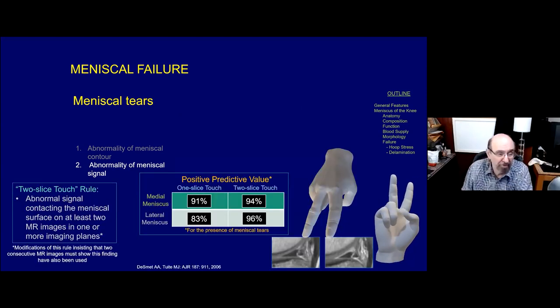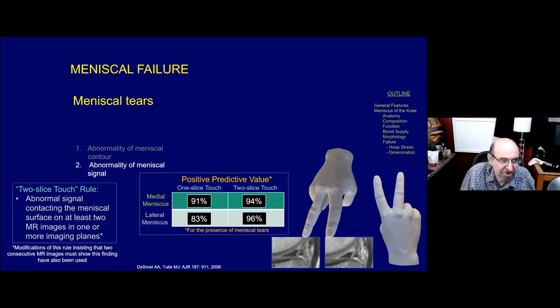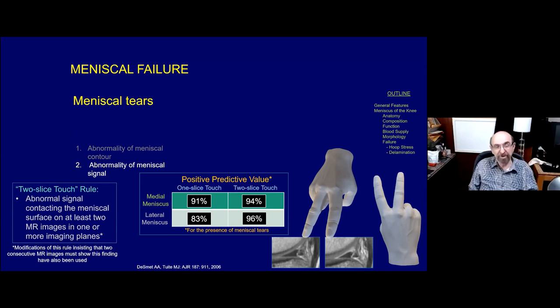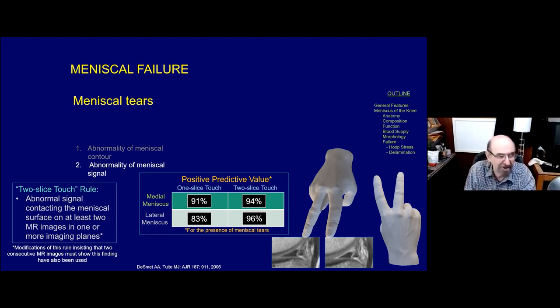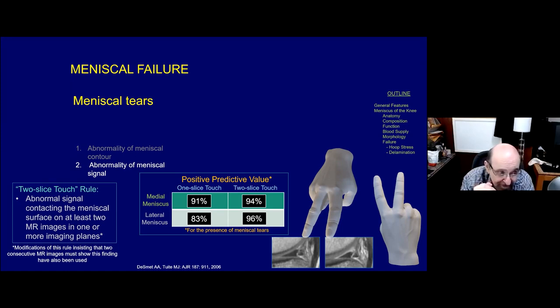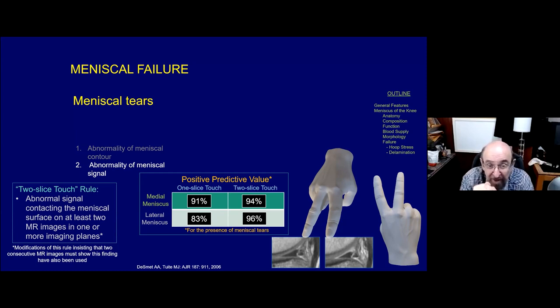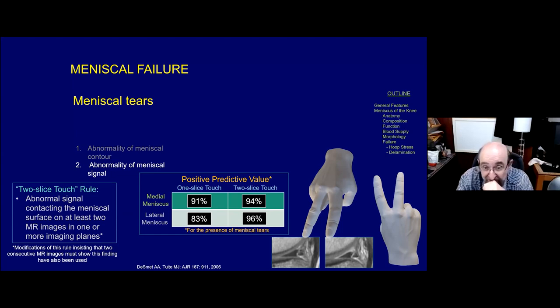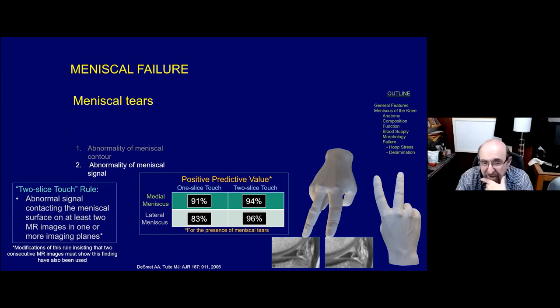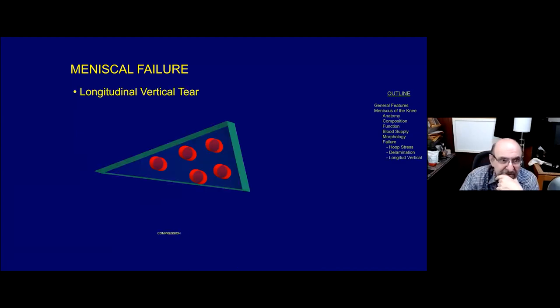Another suggestion to make the second criterion more reliable is the two-slice touch rule - the idea being that if you saw disruption of the surface of the meniscus in more than one image, either in the same plane or in multiple planes, it improves your diagnostic abilities. Data from Wisconsin shows that two-slice touch increased reliability and positive predictive value, particularly for the lateral meniscus.